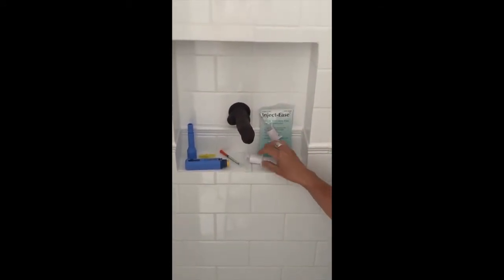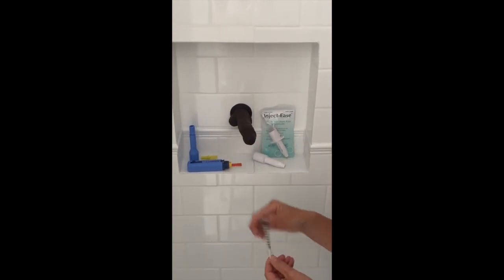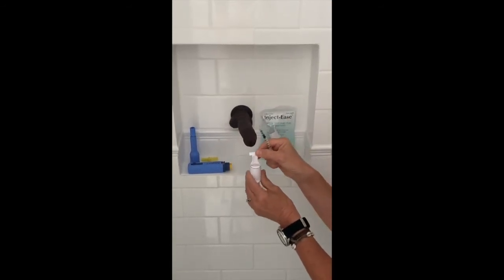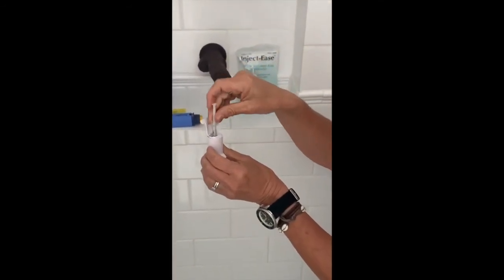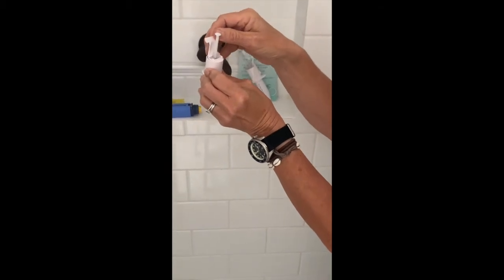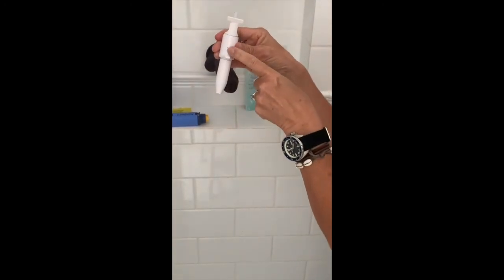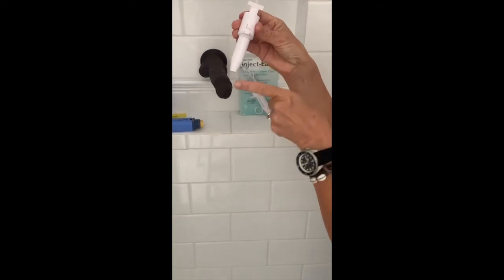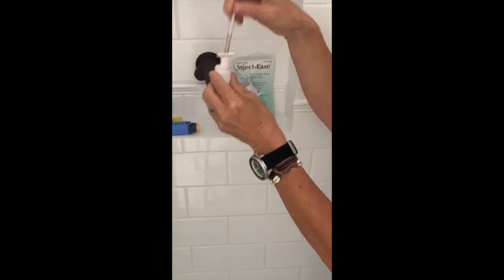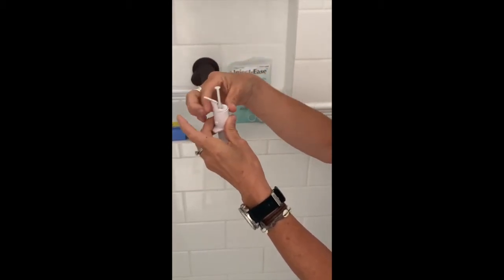First is the inject-ease. On the video on how to inject, I've shown you how to use this, but I'll show you again. Let's pretend you've got your syringe with your medication in it. You pop it into the auto-injector like so. You'll notice this little bit here clicks in and out — if you click that in, that locks it and gets it ready to go. If you don't click that in, when you press the button, nothing happens. When you want to get it back up again, you pull it open, take your needle out and throw it away.